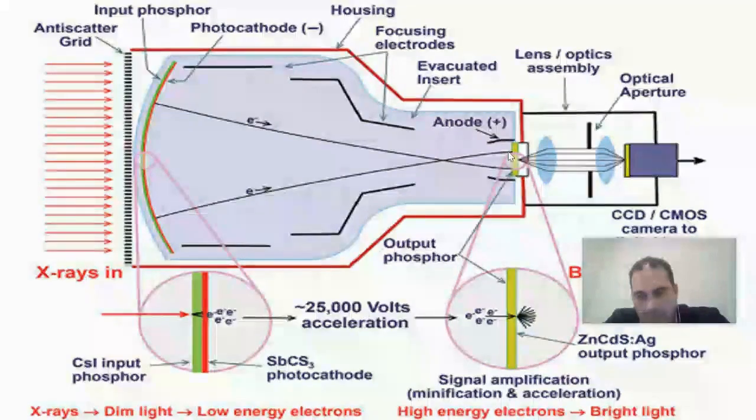Well, this is the camera's job, and it's quite simple. You have the image, and you know it's coming to you inverted. Is there any missing data? No. Is there a problem when we adjust the image?